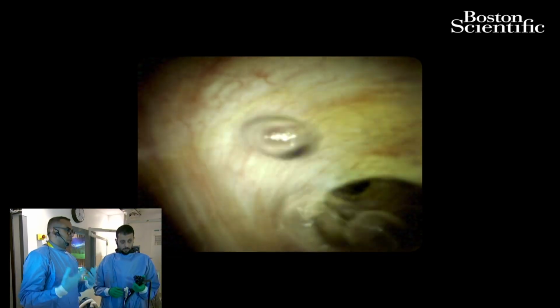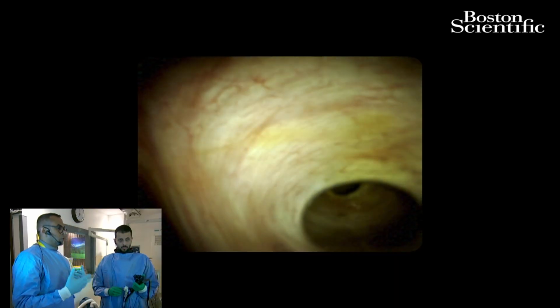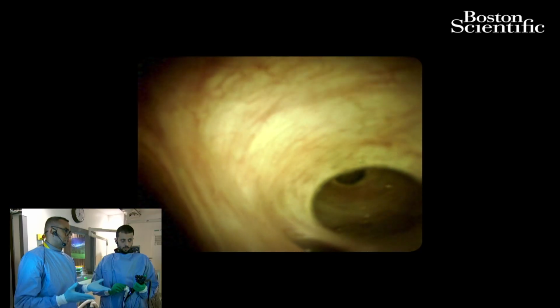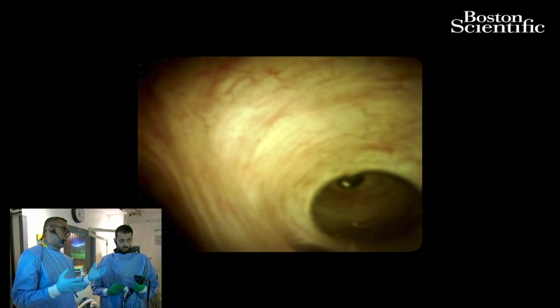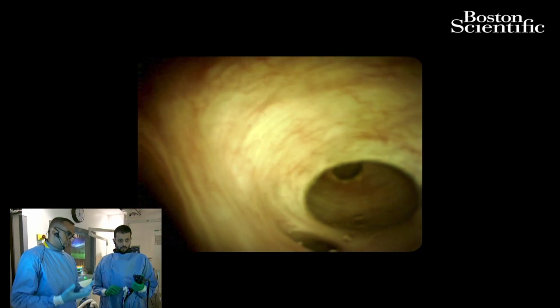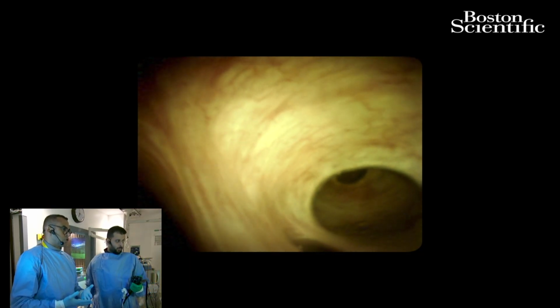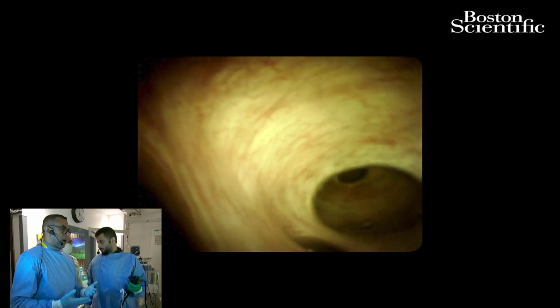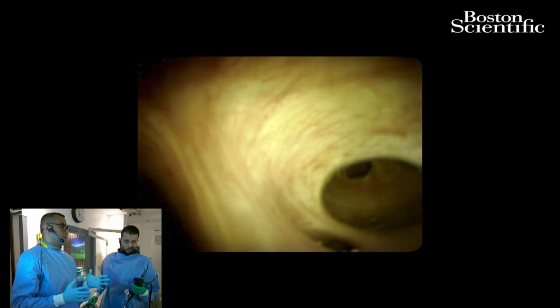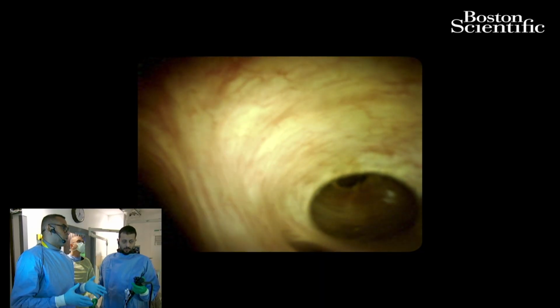We can be very skeptical about what could be the cause of this stricture. Could it be the clinical scenario of having a cholecystectomy in the past? Could it be a stone that passed and formed a stricture? Could it be a focal or severe cholangitis that resulted in such a complication, or an impacted stone? You could go on about the reasons for this formation.